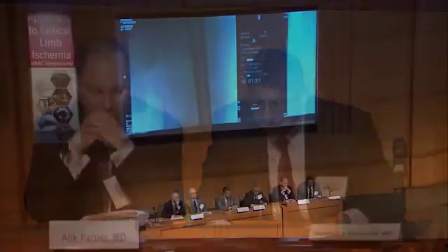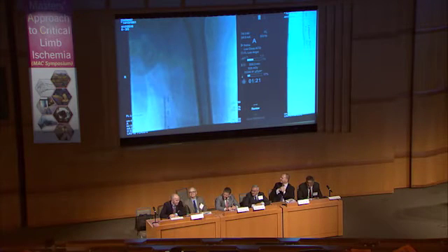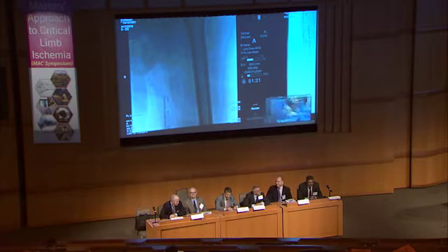So next question. Now that we have solved the most important issue, let's get into the minute details and give you some more trouble and make your life a little bit more complicated. How are you going to size your Viabahn? I'm sure you have addressed this with your fellows many times, but enlighten us, because we can always disagree with you. Go ahead. Of course, if you disagree, you'll never be invited back. Exactly.